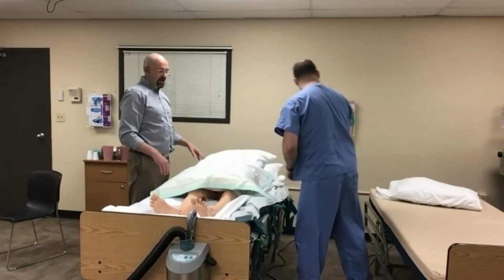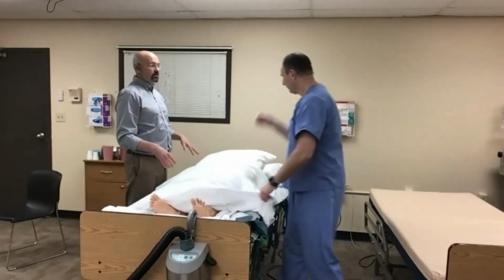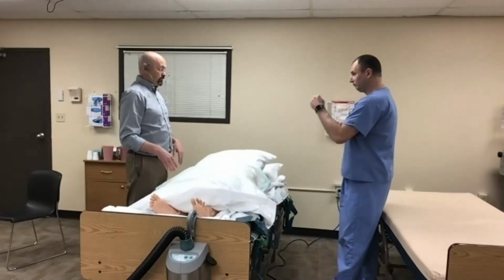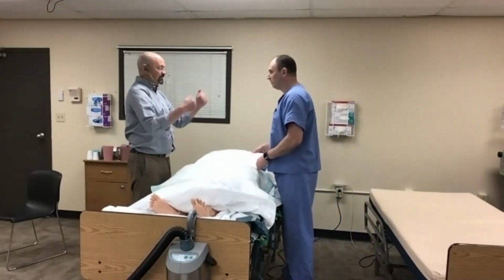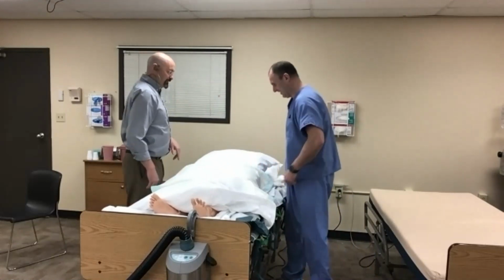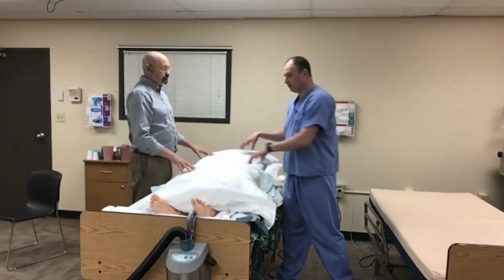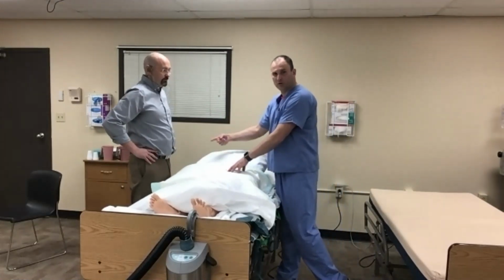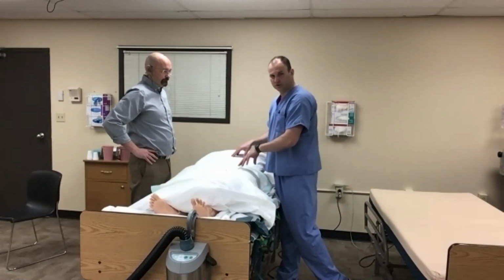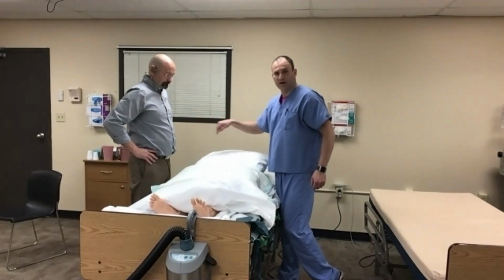So what we're doing now is getting our pillows lined up. When we go to turn him, which way are we going to turn him? Toward me. Toward you. Actually, we're going to turn him towards me, because I already put the arm. Okay. So we're going to put the handrail up on that side. The challenge is the pillows. When you flip somebody over, if you don't tuck the pillows just right, they're going to end up kind of shooting out the other side.